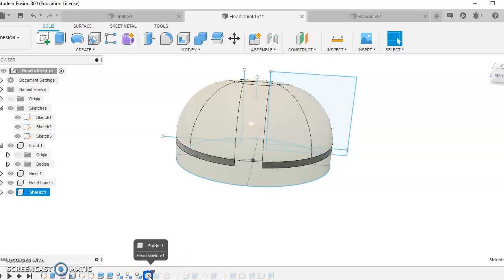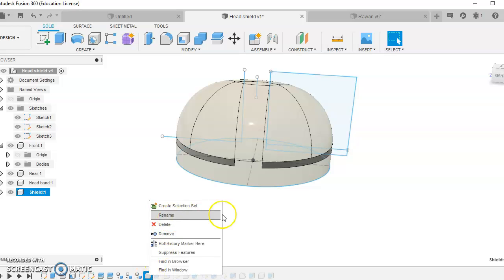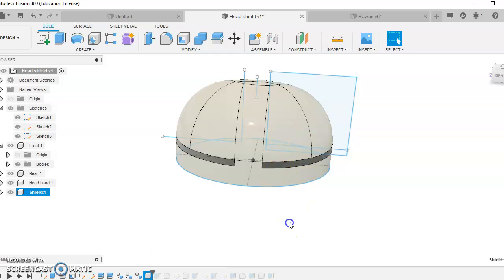Okay, so then once you've got that part completed, you then want to remove some of the material, so you could extrude that. That's not an issue.